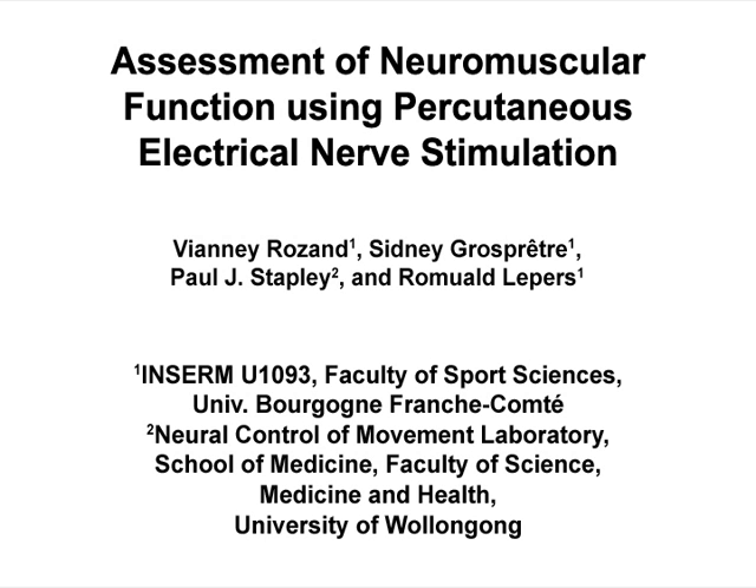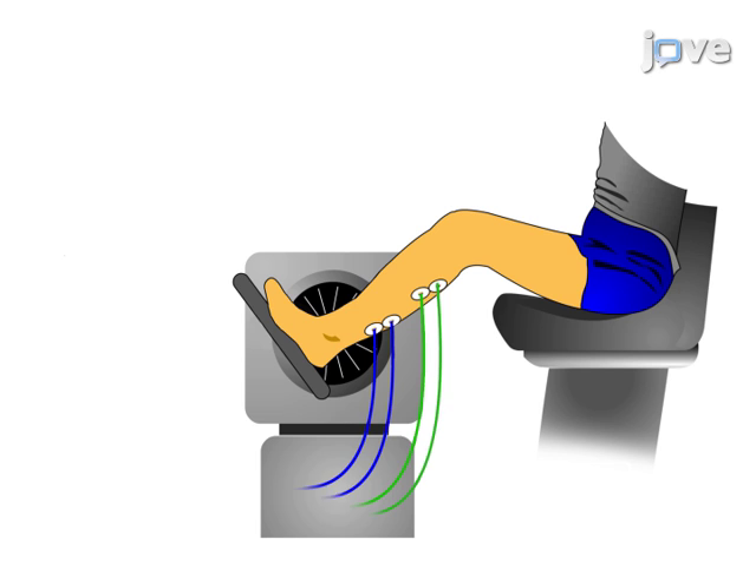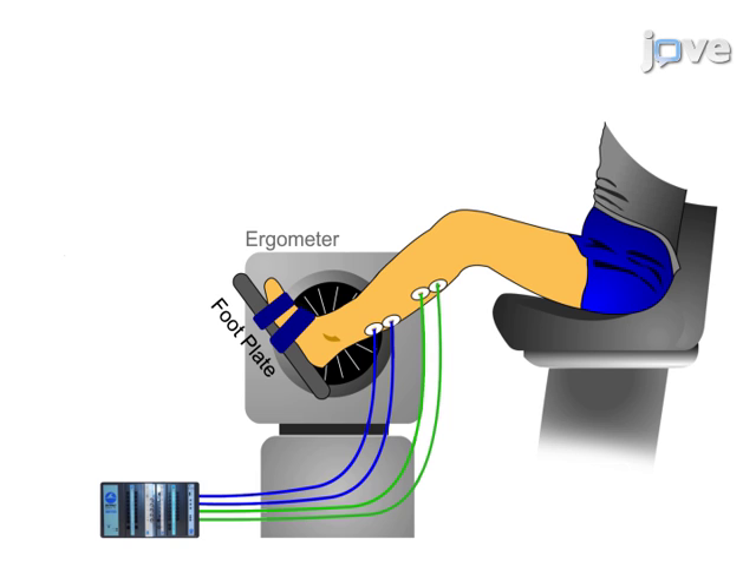The overall goal of this procedure is to assess neuromuscular function using percutaneous electrical nerve stimulation. This is accomplished by first connecting surface electrodes to the desired muscle. The second step is to install the subject on the ergometer.